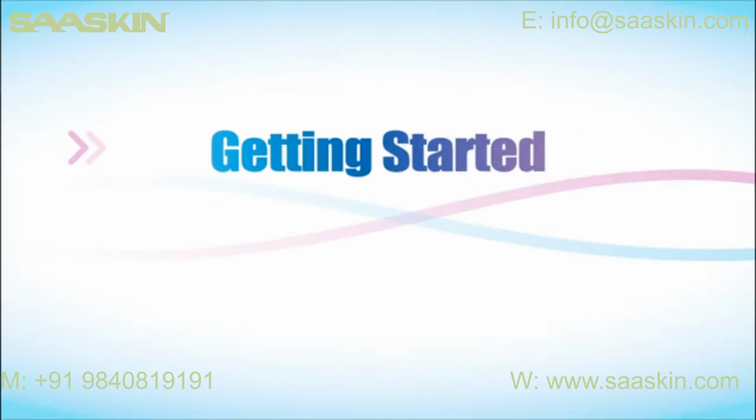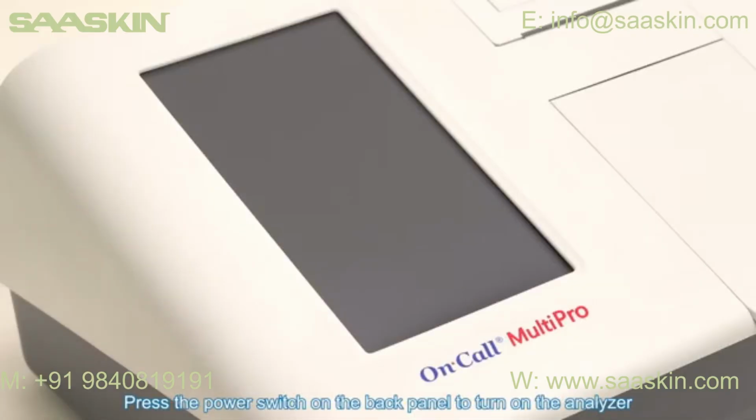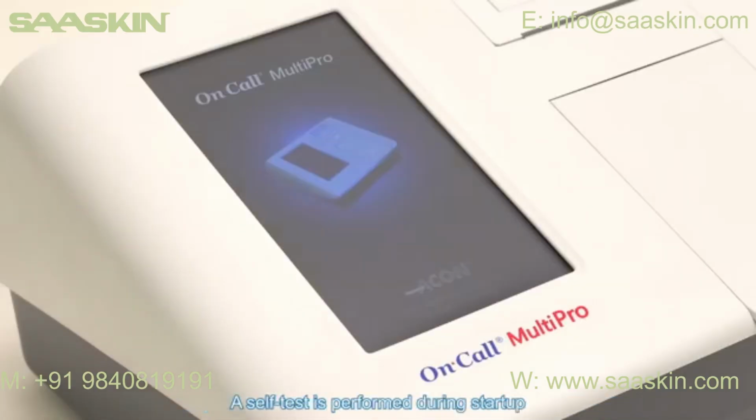Getting started. Press the power switch on the back panel to turn on the analyzer. A self-test is performed during startup to ensure that the analyzer is operating properly.